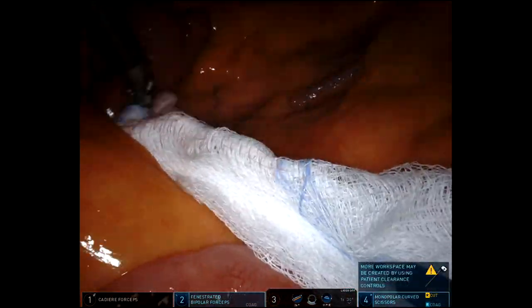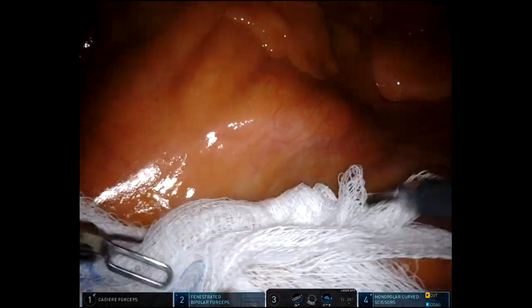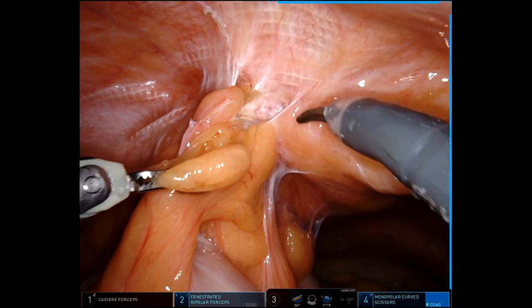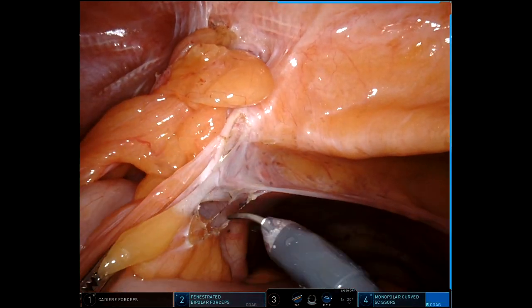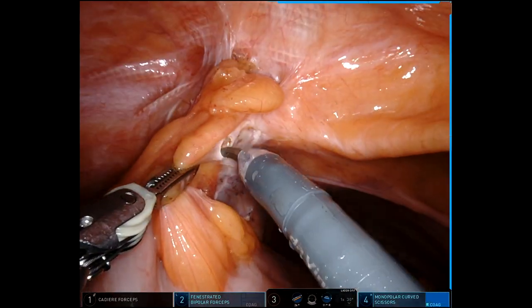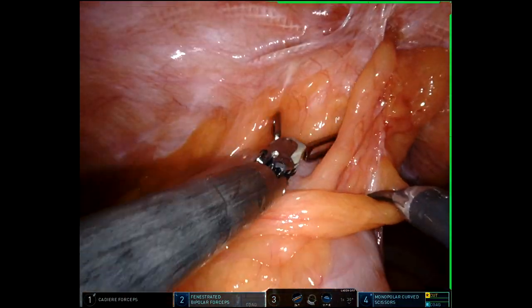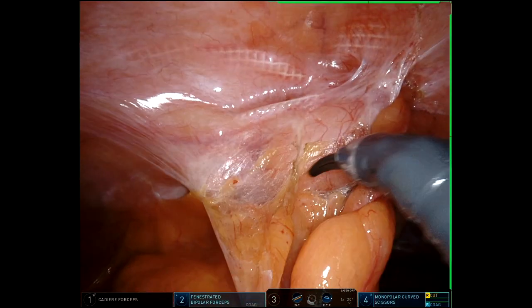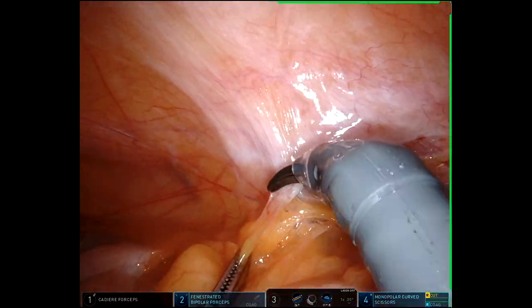Hello. I'm sharing a sigmoid resection for a distal sigmoid cancer with an anastomotic revision at the end. Usually for malignancies I do medial to lateral, but this patient has some adherence of the sigmoid colon to some inguinal hernia mesh, and this was precluding my ability to lift the IMA pedicle upwards, and therefore I'm doing a limited mobilization here.